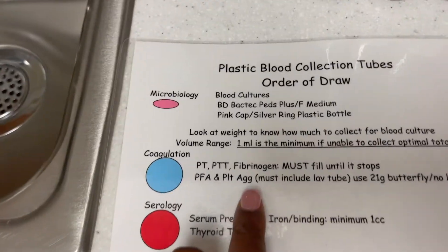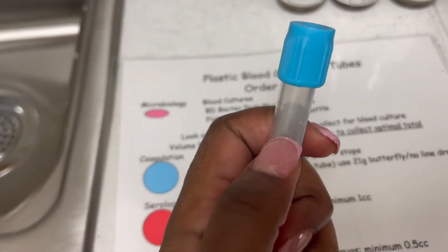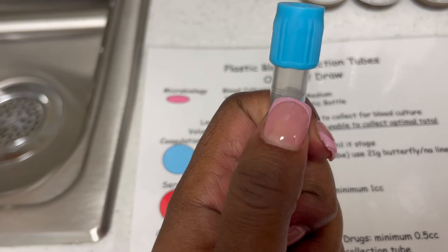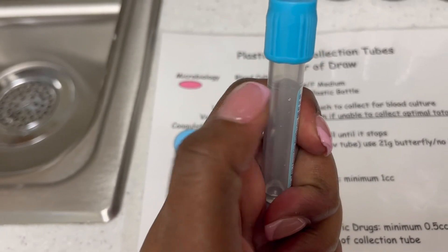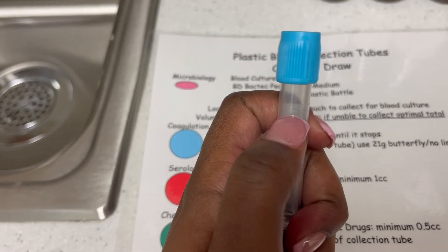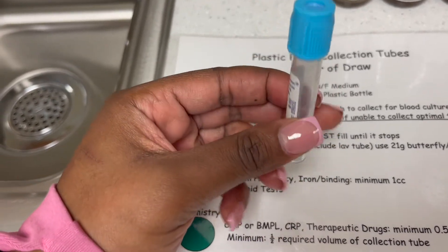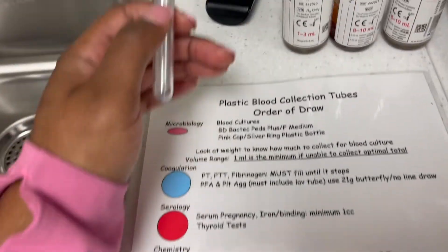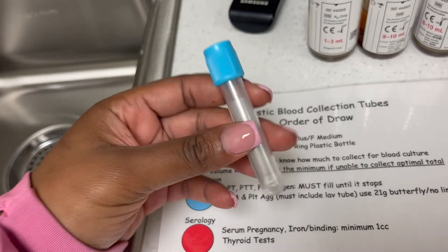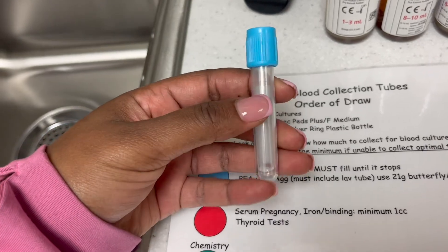Second, we have coag — this is the blue top right here. The key to this is that the vial has to be filled to the line. If you don't fill it to the line, you have to do a redraw because it won't be accurate. Also, when using a butterfly, you need a waste tube — just use another blue top so none of the additives end up in the line. Wait till the blood comes down, then replace it with another one so you can get it filled all the way.